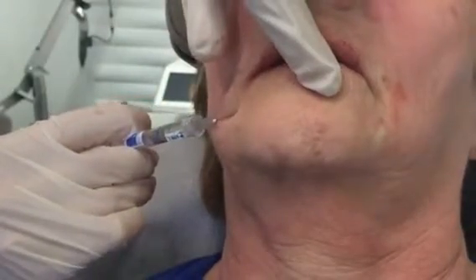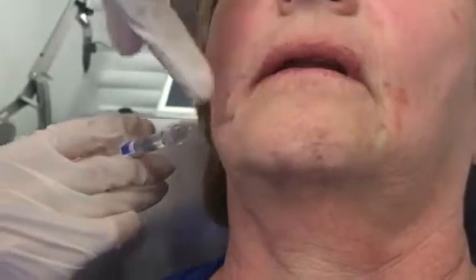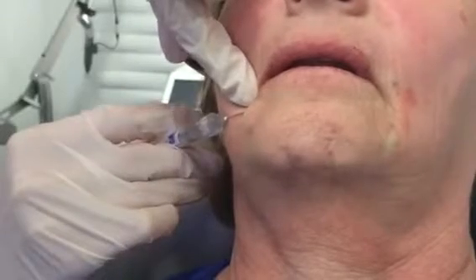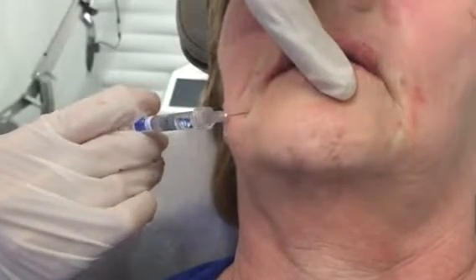The idea isn't that you're bulking this. I'm using just very minute amounts — maybe 1/50th of the syringe — as I'm going across the lip, this white portion of the upper lip.